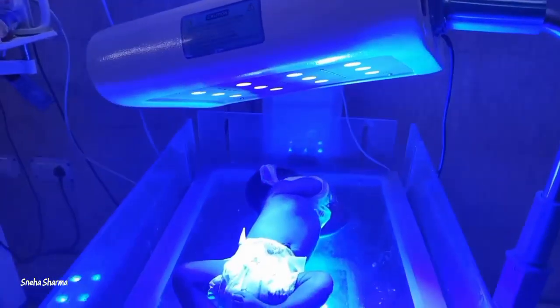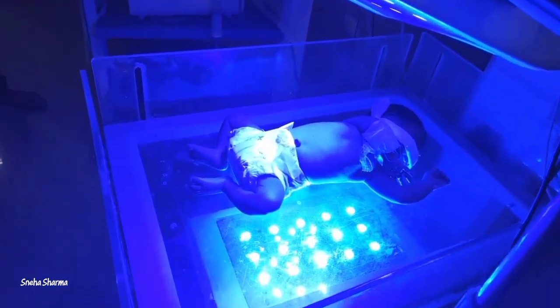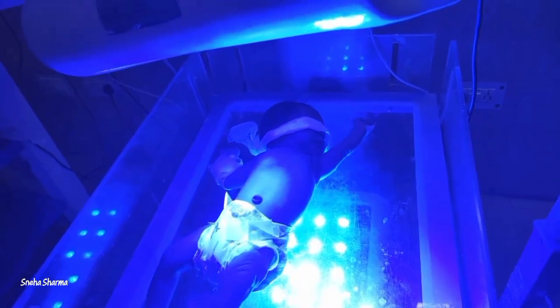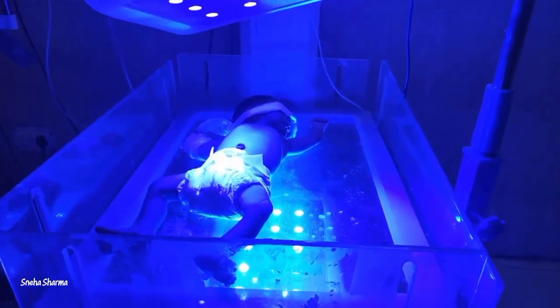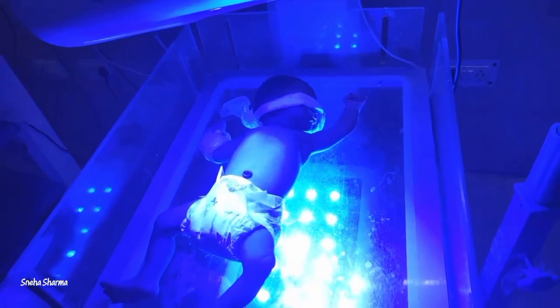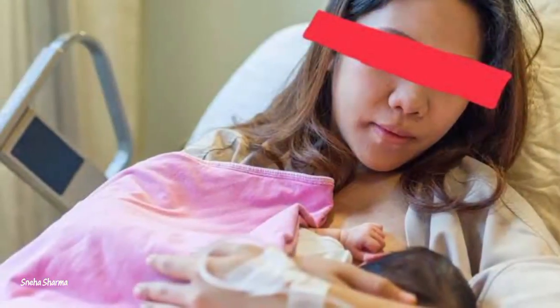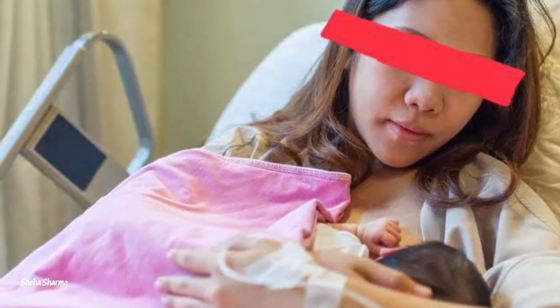The light of wavelength 460 to 490 nanometers is used, and the power of light is 30 microwatts per centimeter square per nanometer. Now, in phototherapy, patients need to wear protective eyewear and cover the genitalia because the rays can damage the eyes and genitalia, and it can cause dehydration in the baby.